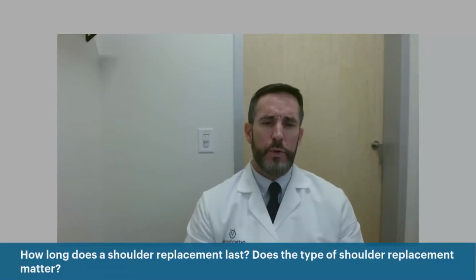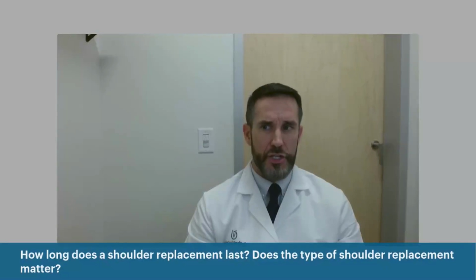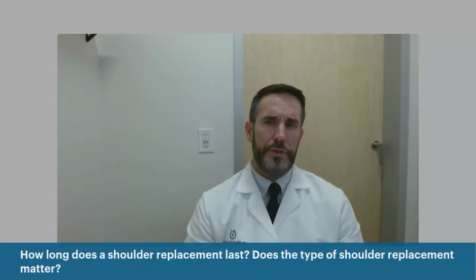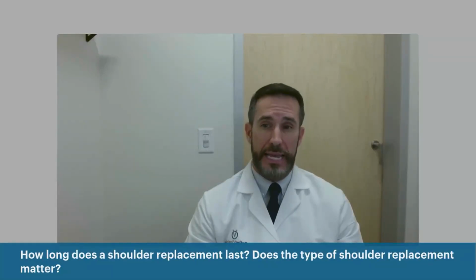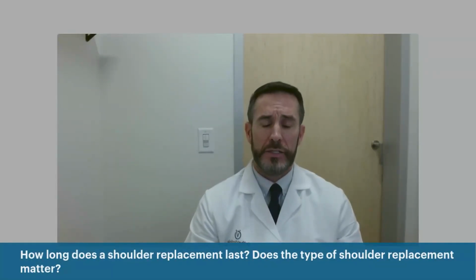I think it's important to assess patients' overall activity level prior to surgery, what their expectations are. And then I think carefully examining their imaging is important, assessing deformity, trying to correct anatomy. And there are a lot of factors that go into this. I will say the materials in the implants, as we went through during the talk, have gotten better.